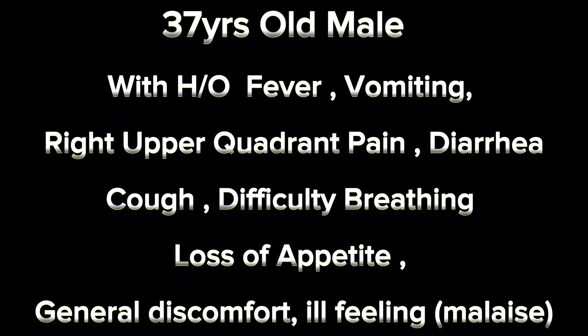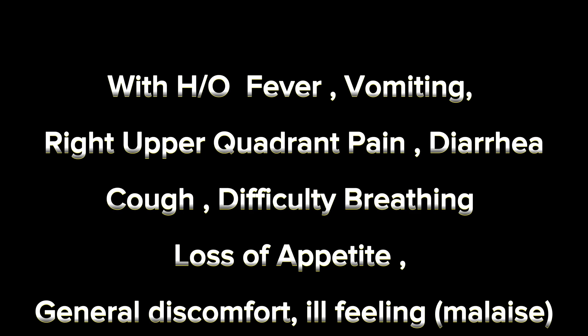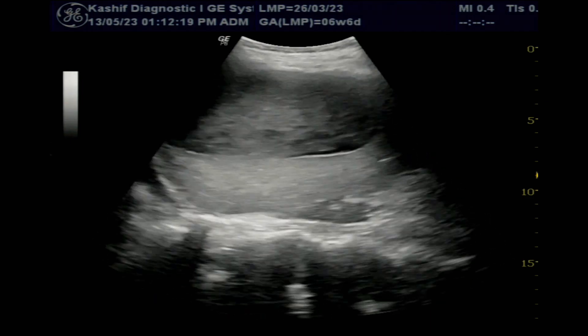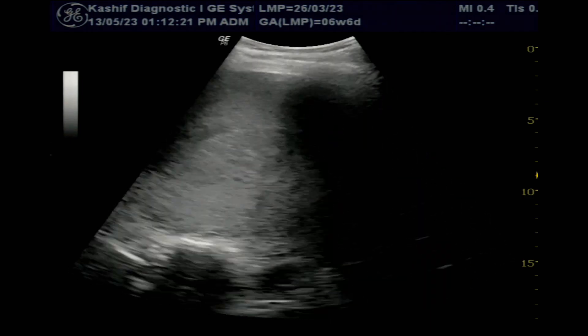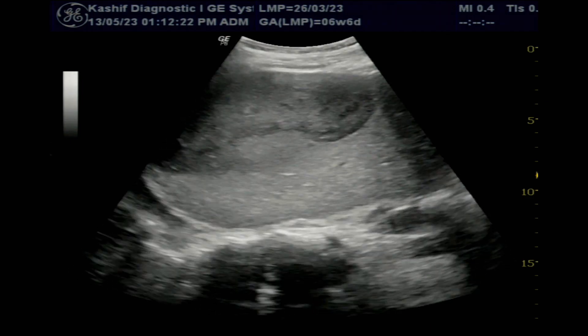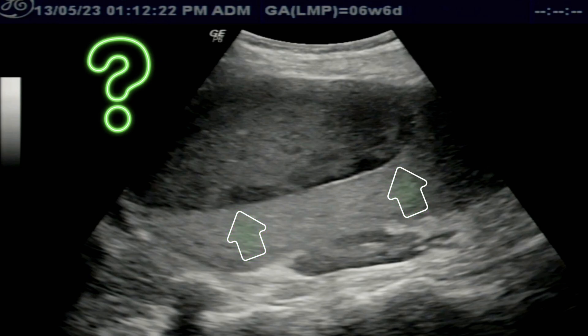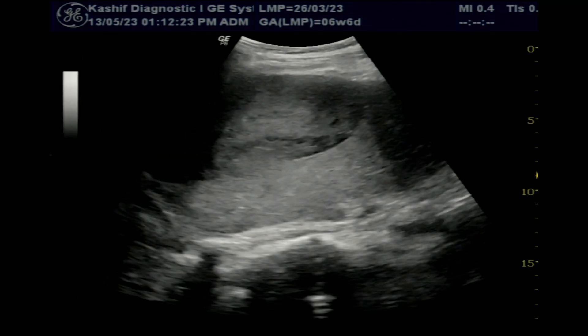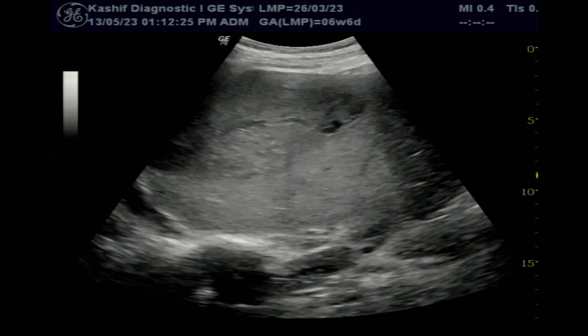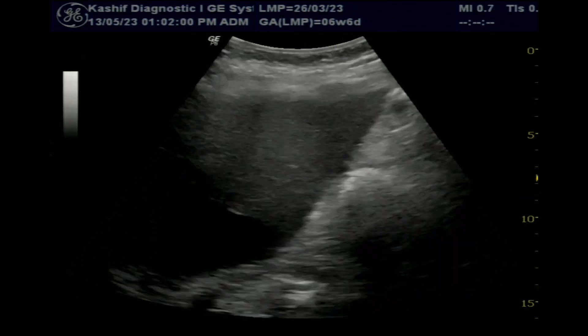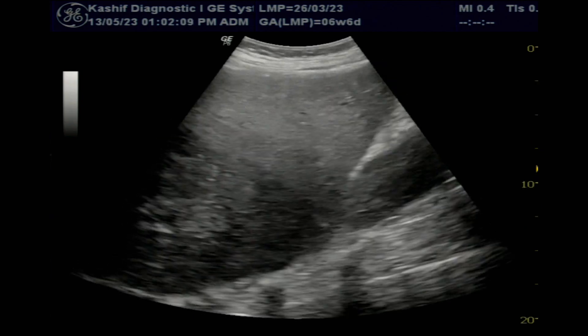This is an interesting and complicated case: a male, 37 years old, with history of fever, not of high grade. Other symptoms are written at the start of the video. In the starting we see a liver and large cystic mass. Now the question is: what is this? Is this a liver abscess? Before answering, it is important to rule out other causes.